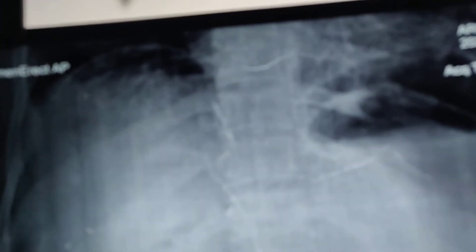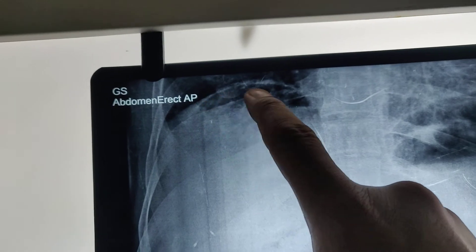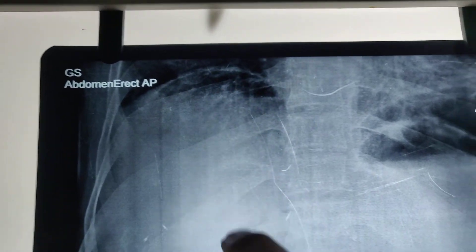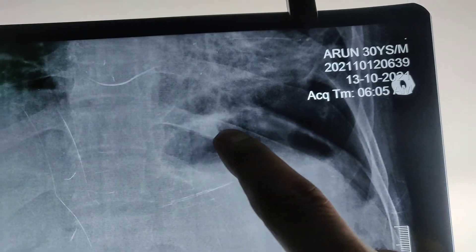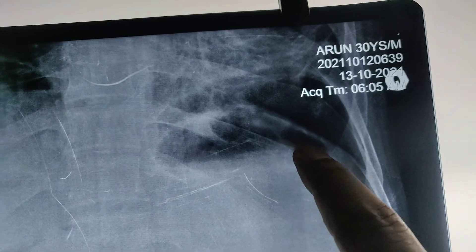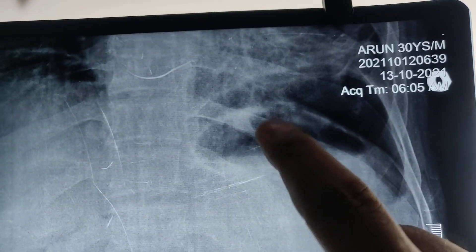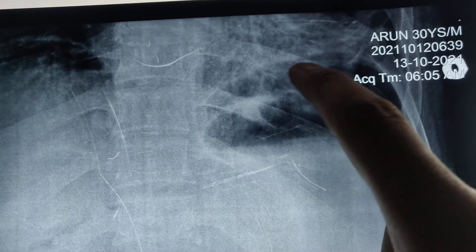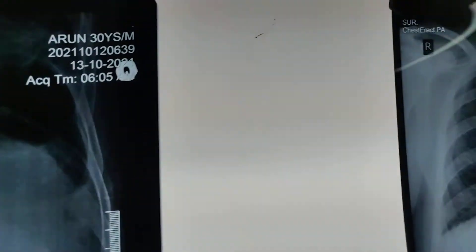You can see here the gas under the diaphragm — on the right side and also on the left side. This is the gas in the stomach, and this is the free gas under the diaphragm.